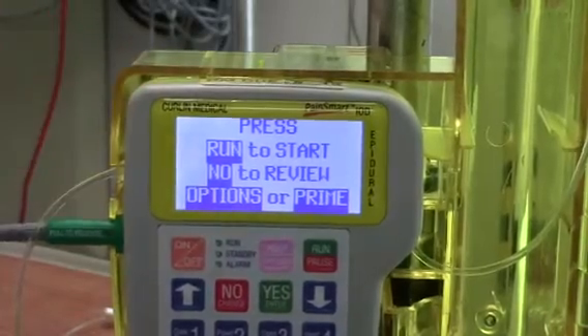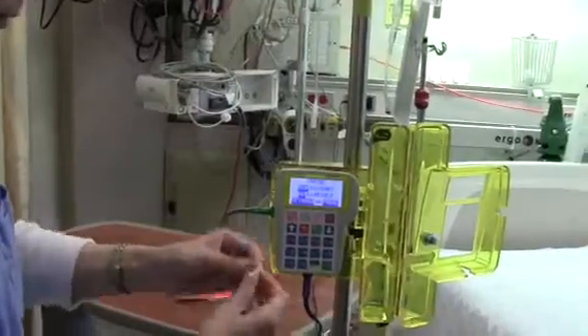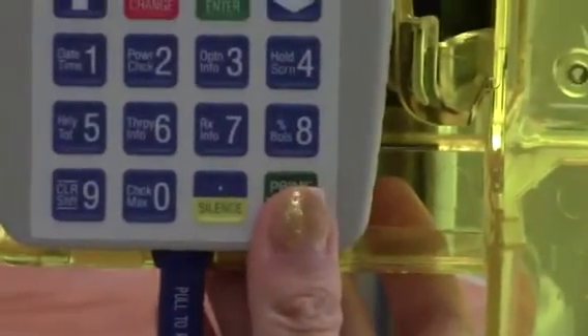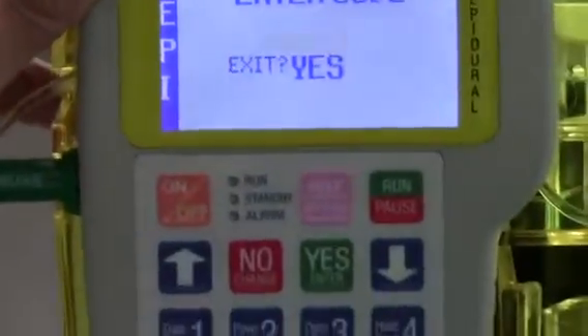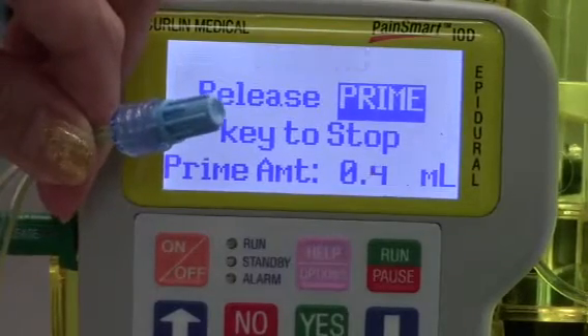At this point, we're ready to prime our pump. Remember to unclamp your IV tubing, and then select the prime function on the left lower edge of the pump and begin priming. It will ask you to enter the code — go ahead and enter the code. Now we're ready to prime. Hold the prime button and begin priming until there are no more air bubbles in the tubing.